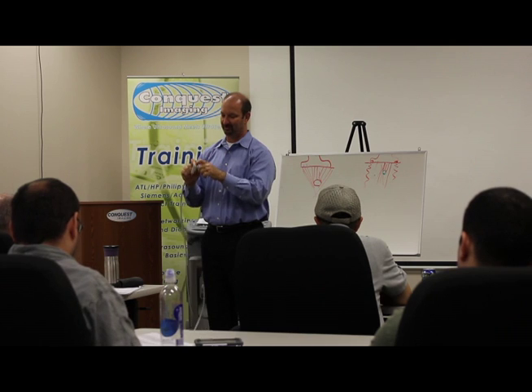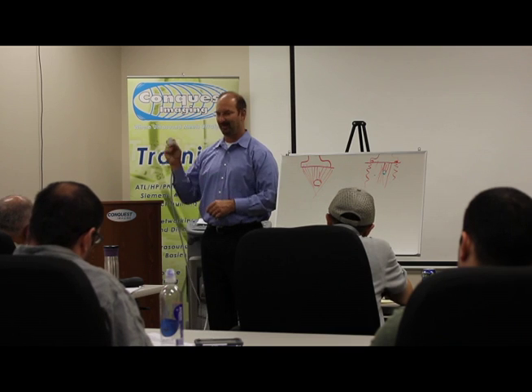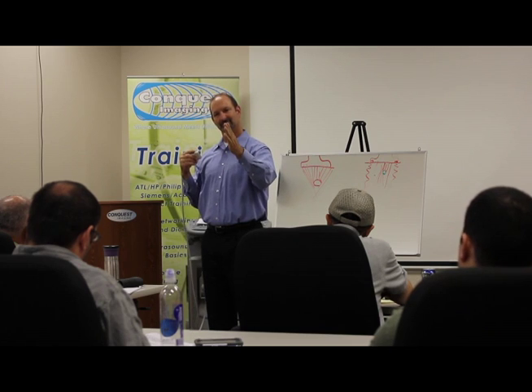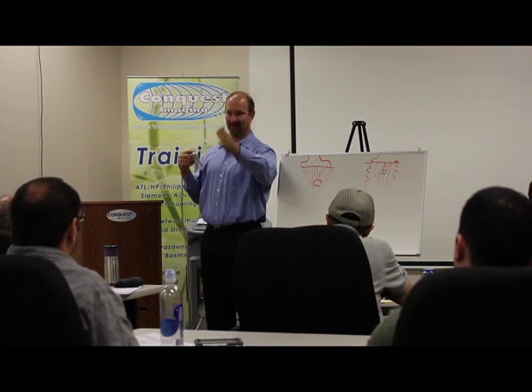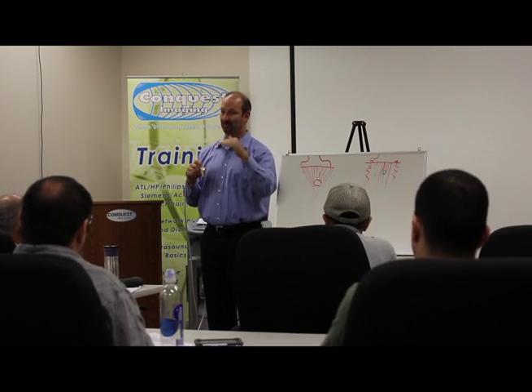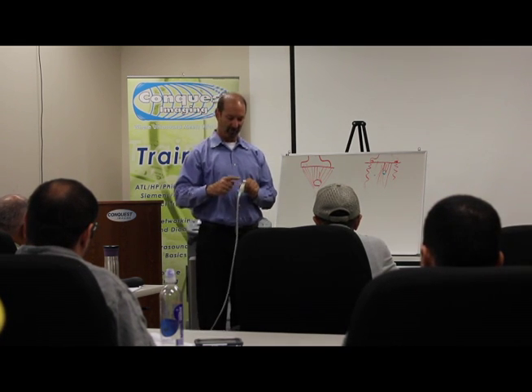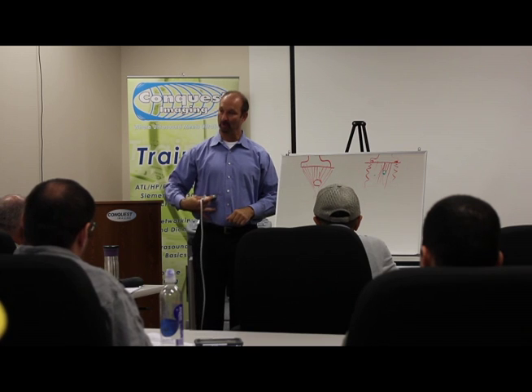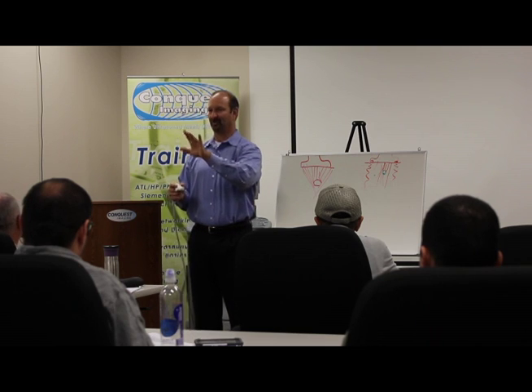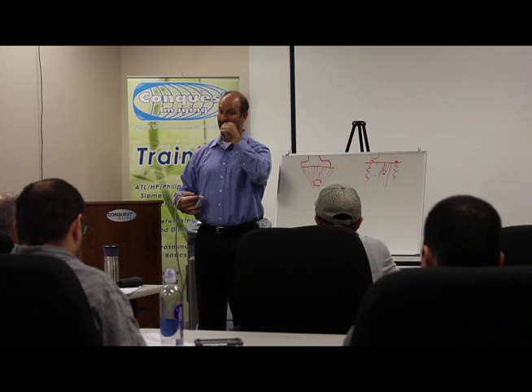So when I've got this long notch that the sonographer can feel in a dark room, and I'm doing this, or doing this, what's on the left side of the screen? It's the marker corresponding to that spot. Right, it's going to be superior and inferior, top, bottom. When I hold it in the body, the sonographer will always try to have the notch pointing up or pointing towards them if you're doing general imaging. Because when the notch is towards you, the information on the screen that is on the right side of my body will appear right here. So that's for the radiologist.